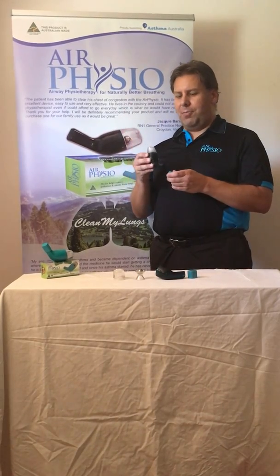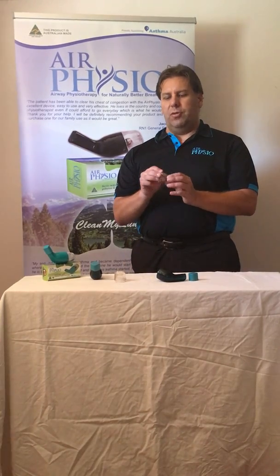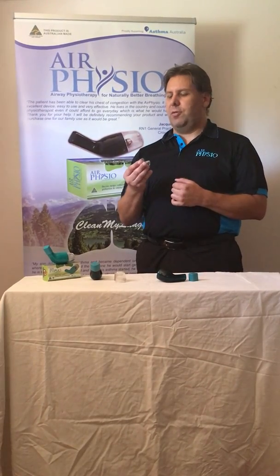Now if you hear that vibration, what that is is simply this. This is the whole device pulled apart — very simple and easy. The stainless steel ball creates a seal on the cone so that when you actually blow into it, it creates PEP, or the positive expiratory pressure.